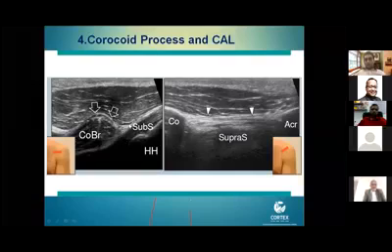Here you have to look for anterior medial impingement in cases of shoulder pain, because under the coracoid, the subscapularis tendon will cause an impingement that is called anterior medial impingement. We have to assess the patient who presents with anterior medial shoulder pain, so we have to assess this by a dynamic examination.